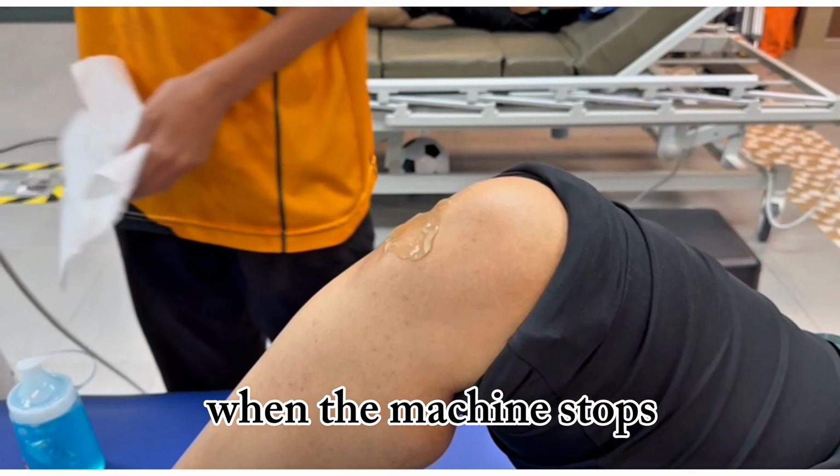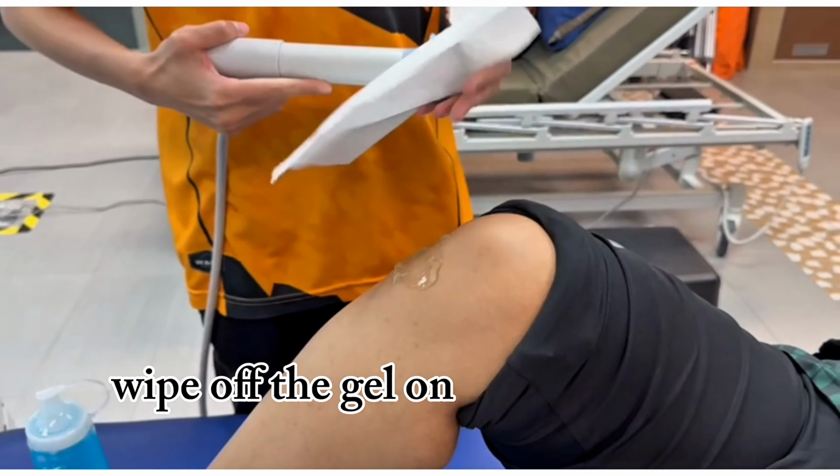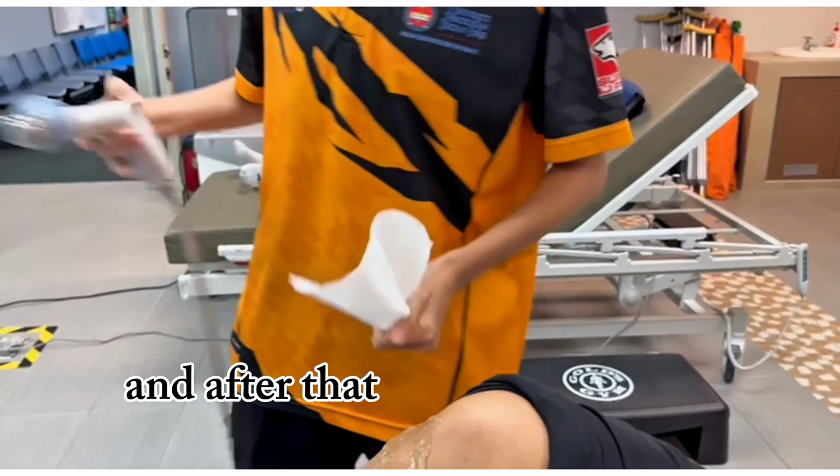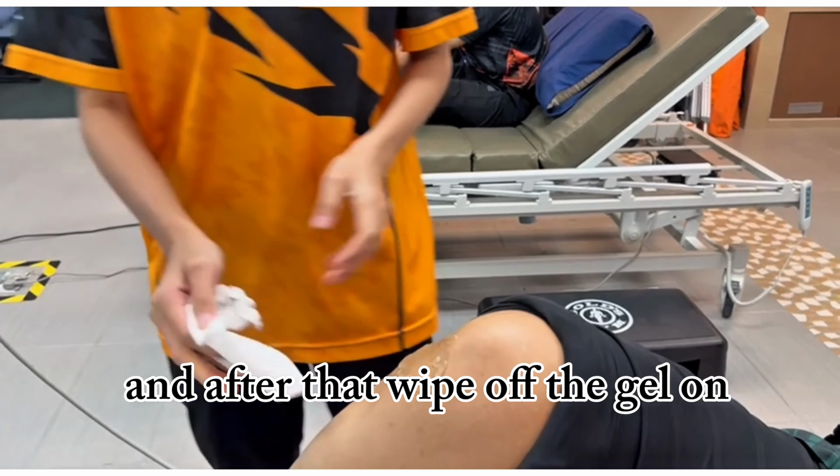When the machine stops, wipe off the gel on the head of the applicator, and after that wipe off the gel on the patient's leg.